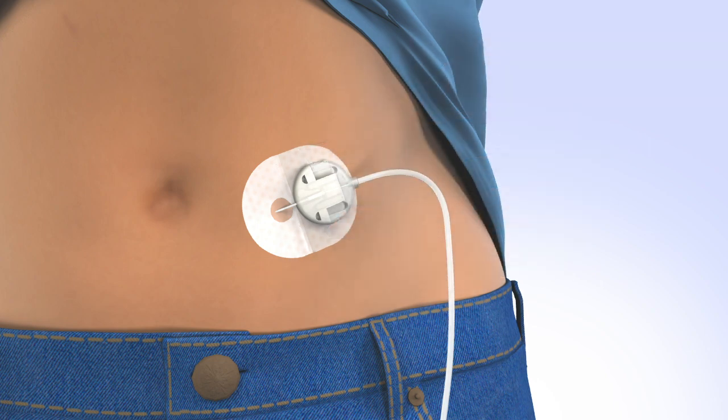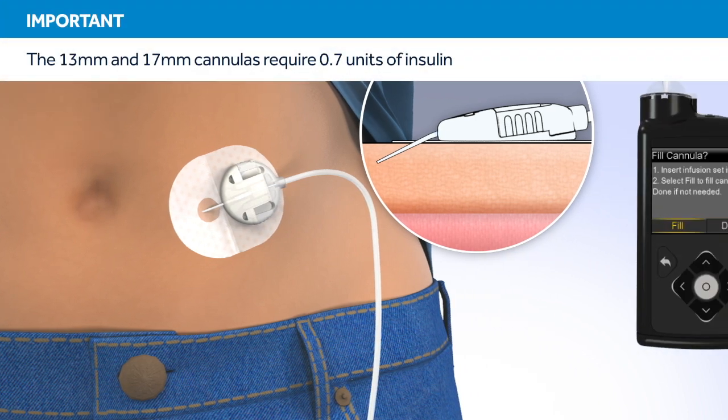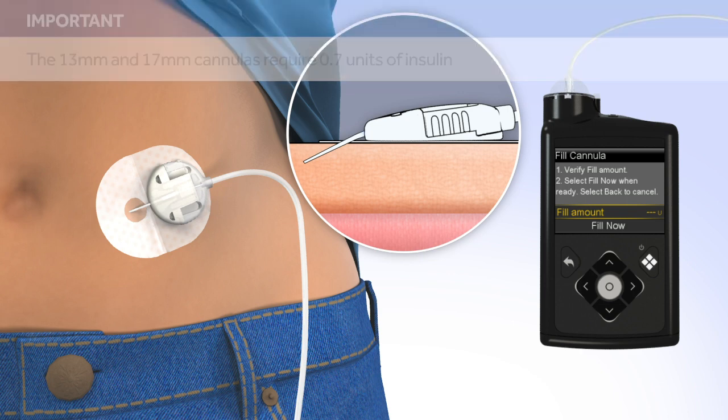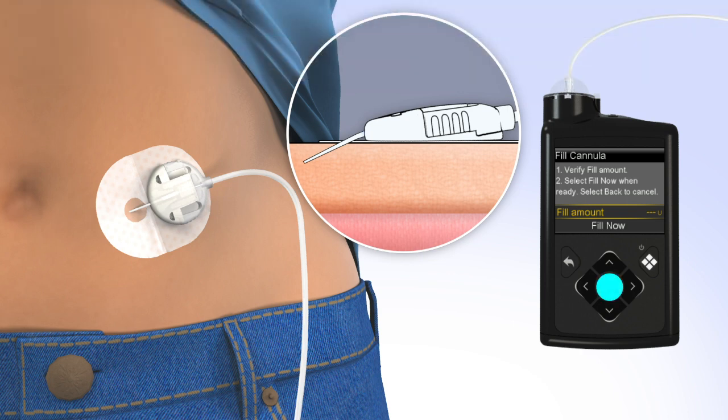Now that the introducer needle is removed, the cannula is empty and will need to be filled with insulin. On your pump, select Fill. The fill cannula screen will appear with either dashes or the amount you previously used. The amount needed to fill the cannula depends on the length of cannula you are using. To change the fill amount, press Select and use the arrows to scroll to the amount needed, and press Select again.